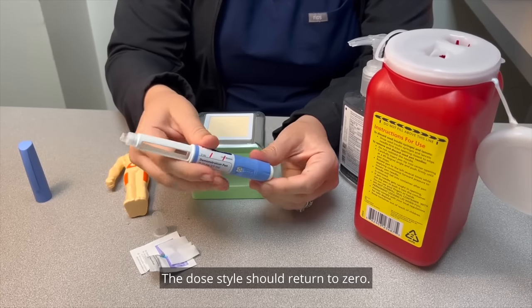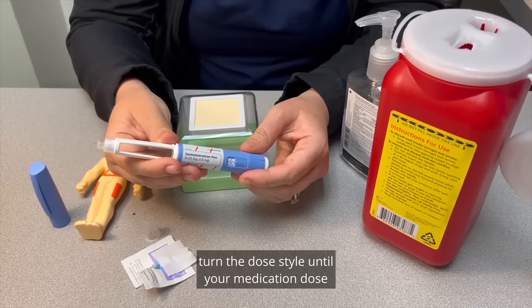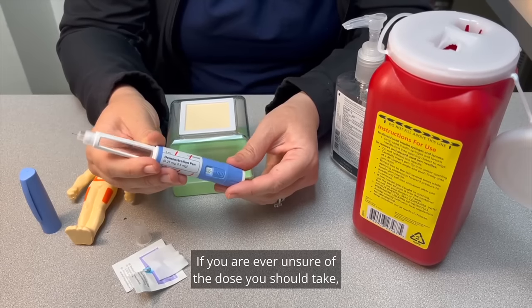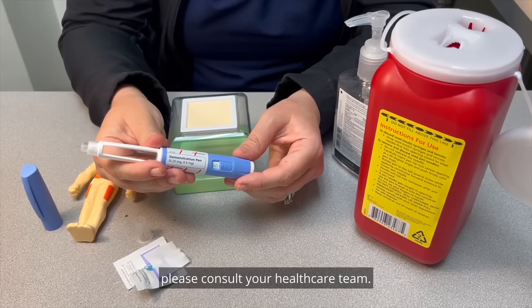The dose dial should return to zero. Once you have primed it successfully, turn the dose dial until your medication dose is in the window that matches the medication dose you should be taking. If you are ever unsure of the dose you should take, please consult your healthcare team.